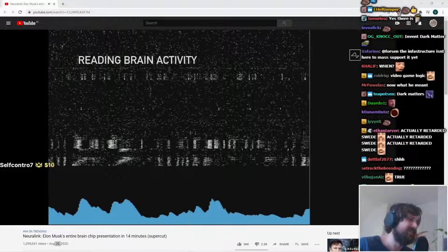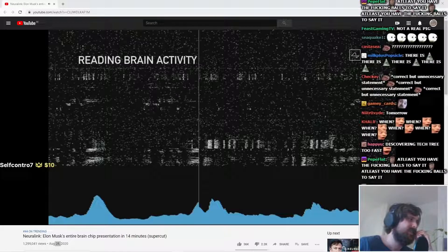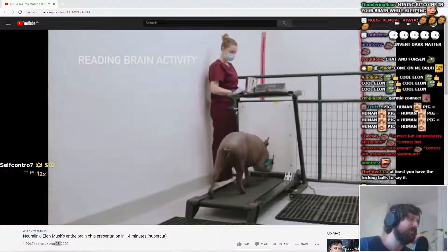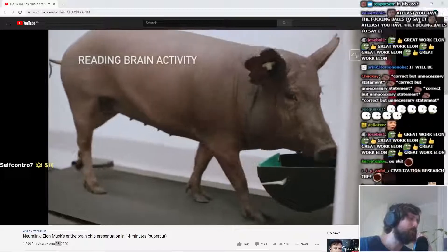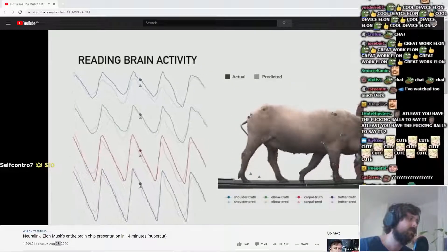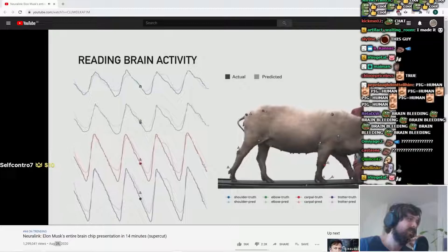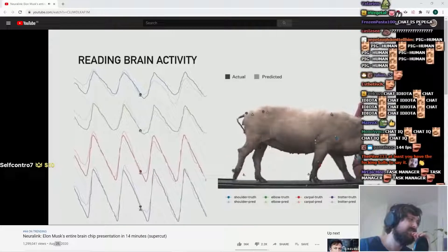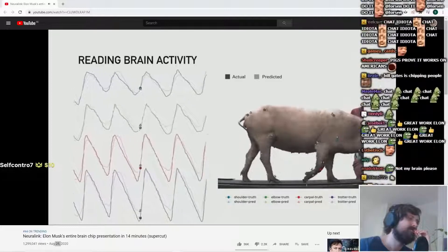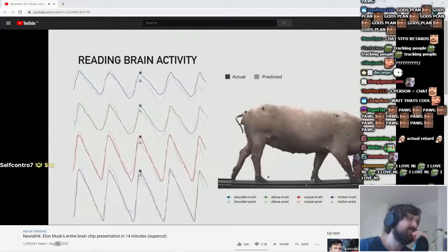As I was saying, each of those dots represents a neural spike and the blue chart at the bottom is showing an accumulation of neural spikes in that region. One of our pigs on a treadmill — we take the readings from the neurons and we try to predict the position of the joints. We have the predicted position of the joints and then we measure the actual position of the joints, and you can see that they're almost exactly aligned. We're able with a wireless neural implant to predict the position of all limbs in the pig's body with very high accuracy.